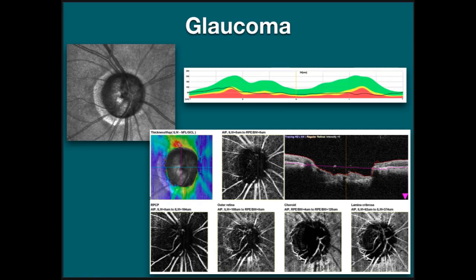This is another glaucoma patient with an inferior temporal notch in the right eye. We can see that on the RNFL scans. He's lost a lot of RNFL inferiorly. He had better central fixation, so we're able to get decent OCT angiography. And again, in the deepest layers, the blood vessels seem to be relatively intact, but in the most superficial layers, the capillaries around the RNFL, you can see significant dropout from about 6 o'clock to 9:30 in that area, and a little bit also superior nasally in that eye.